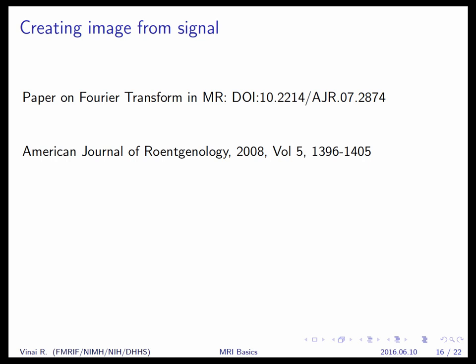If you look at K-space on the same 2D grid like you would the image, in the middle point there's no variation at all. That's your DC, kind of your image average. If you go 1 point off along the x direction, then you have 1 cycle of variation along x. If you go 1 point off in the y direction, then you have 1 cycle of variation in y. And if you go along the diagonals, there's a hybrid function that does both 1 cycle of variation in x and in y.